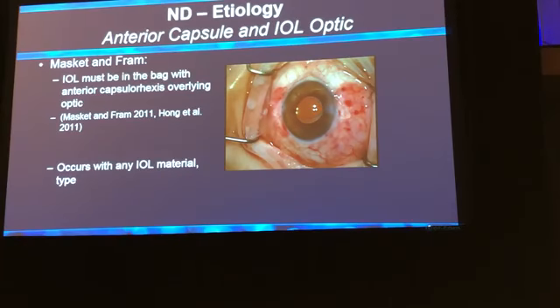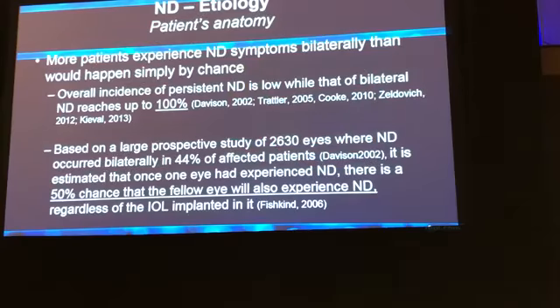Unfortunately, that's not true, because I just saw a patient a few months ago that actually had a lens in the sulcus and had negative dysphotopsia. So that can't be the only etiology.